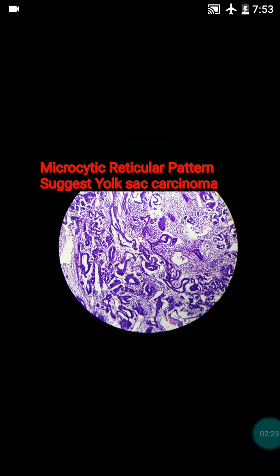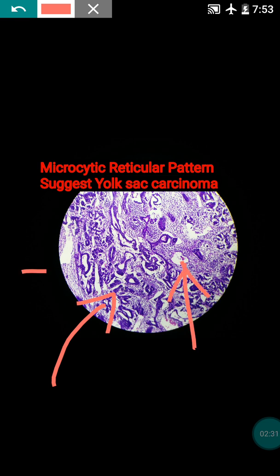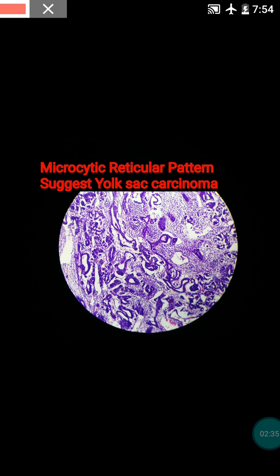During our analysis we observed microcystic reticular patterns in the low power view. These microcystic reticular patterns are suggestive of yolk sac carcinoma.